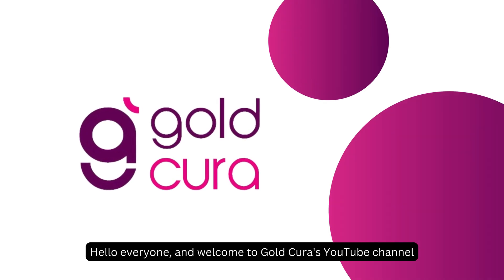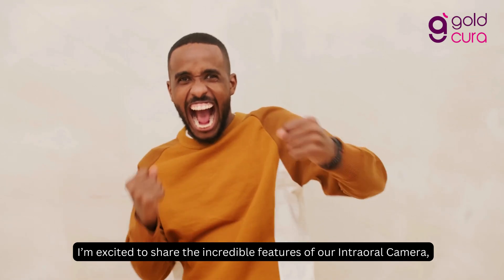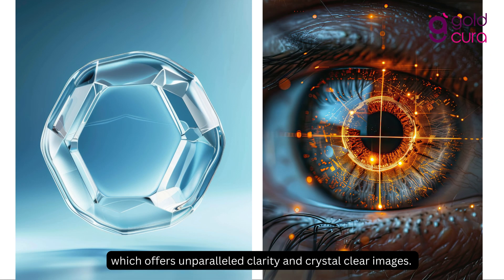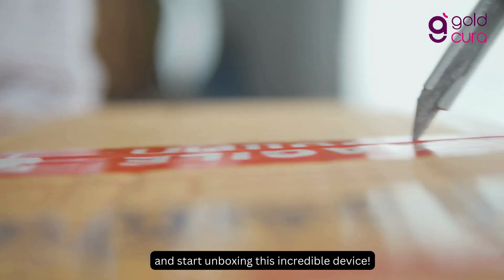Hello everyone, and welcome to Goldcura's YouTube channel. Today, we'll be exploring our 18-megapixel dental intraoral camera with screen. I'm excited to share the incredible features of our intraoral camera, which offers unparalleled clarity and crystal clear images. So let's dive right in and start unboxing this incredible device.